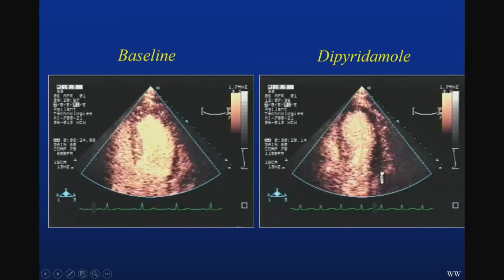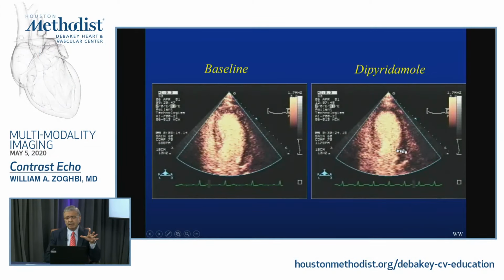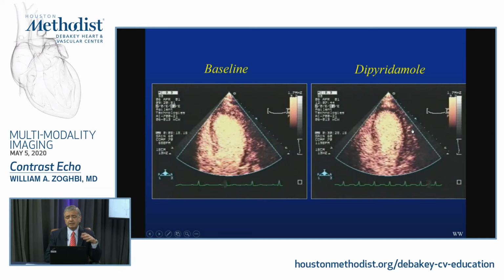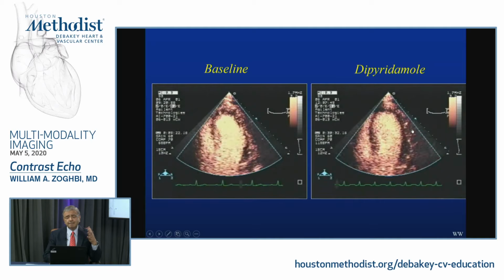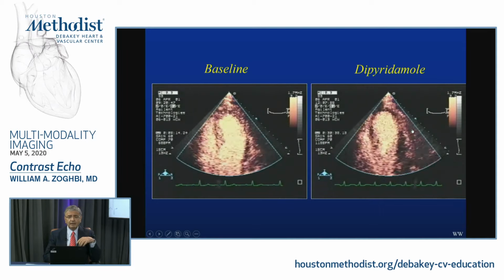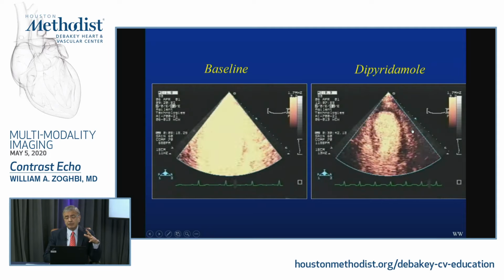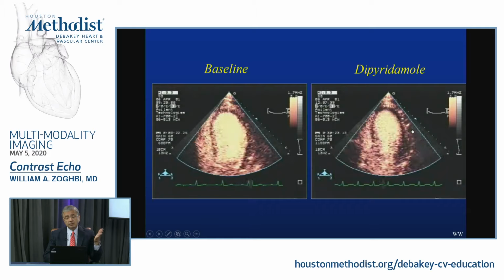Why do we have some issues with it? Because there is some attenuation here. We don't see as well in the base of the heart as opposed to the apex and apical cavities. So, I mean, there are issues, a lot of variability, and it is laborious, I would say. It's a great research tool because you could look at flow at different times and after various interventions, right? And it is rather safe. So that's the beauty of it, but also we have to be realistic.